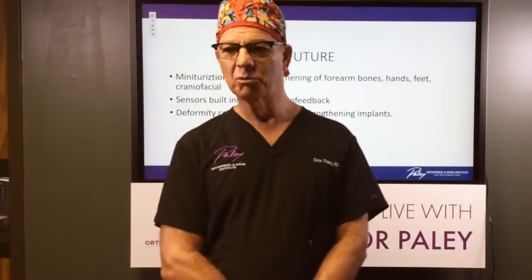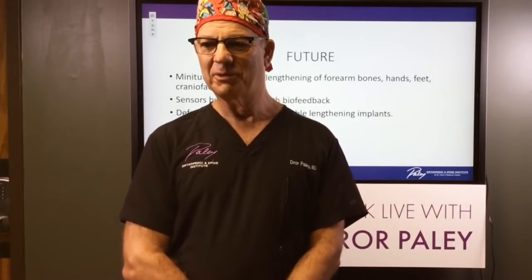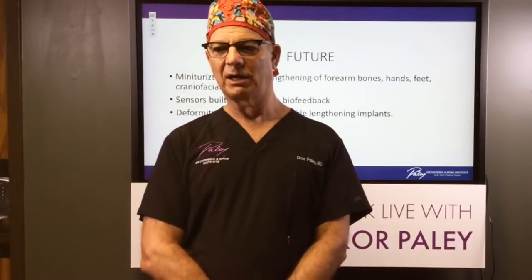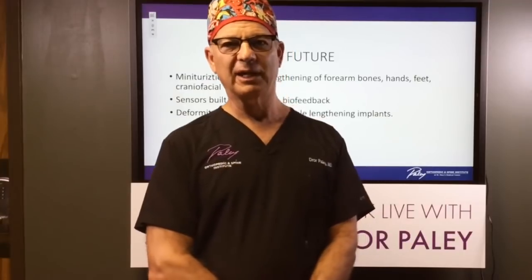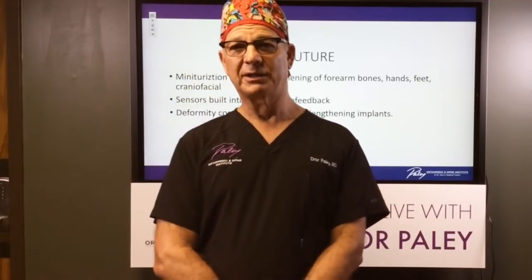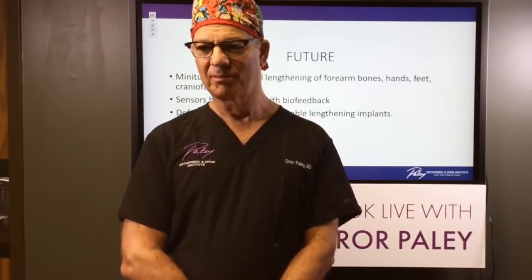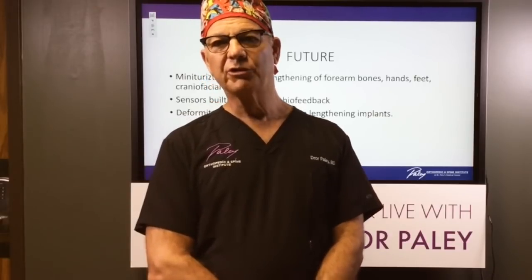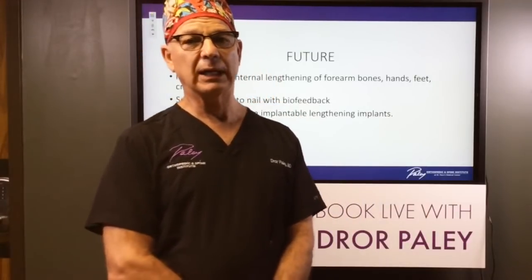Obviously, they're not going to make a sale if this is done the second time. But there is a consideration of the device. There's no experience to say how long these devices are good for, and if the mechanism would break, or the device would break during that second lengthening. So in theory, what is mentioned has been considered, and may have even been done. In practice, in the United States, that's not within the standard of care.